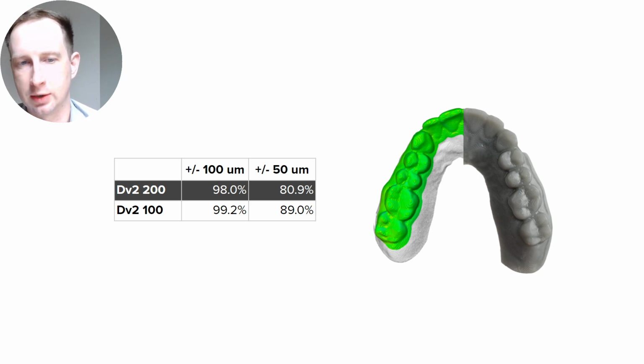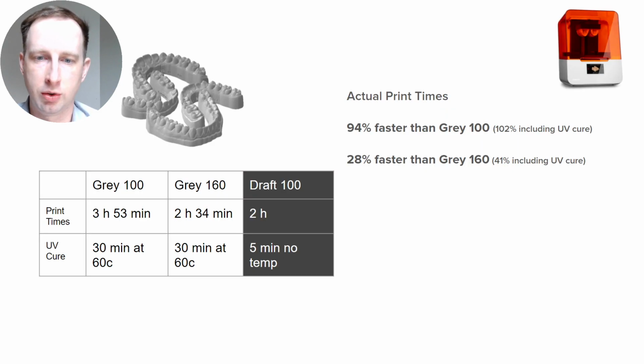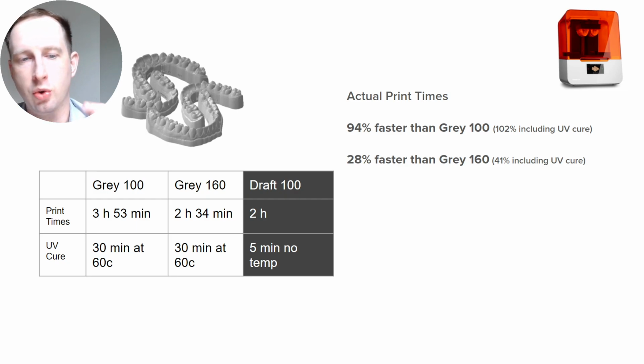That's not a big difference. If you move that tolerance to within 50 microns of the surface, all of a sudden you see 200 microns at 80%, which is still very, very good. 50 microns is a very tight tolerance. That 100 micron setting was almost 90%, 89% within 50 microns of the original file, the original surface. Just really incredible. Quick comparison on the same ones I did earlier on 200. This is Draft 100.